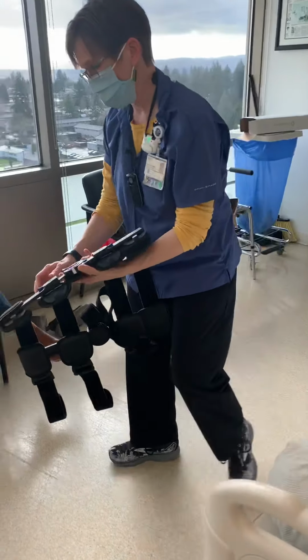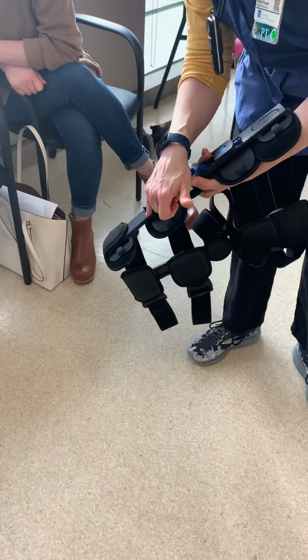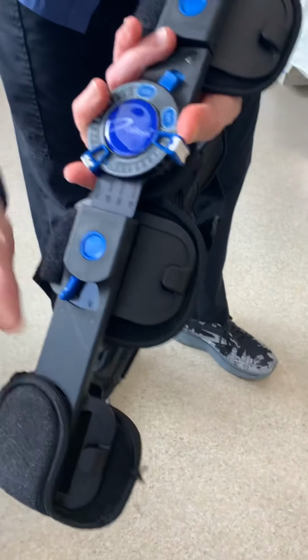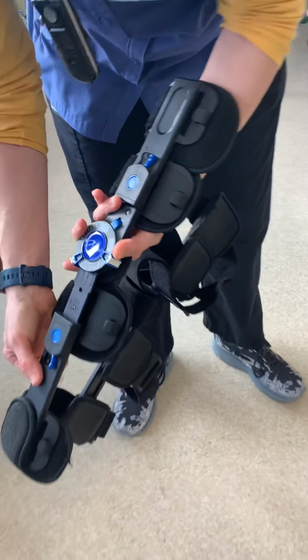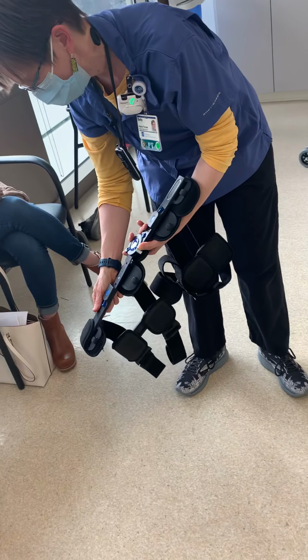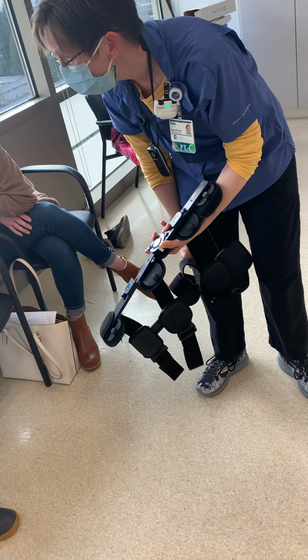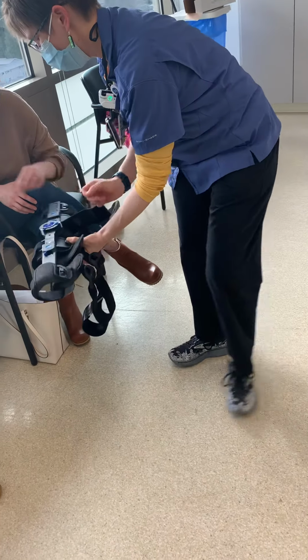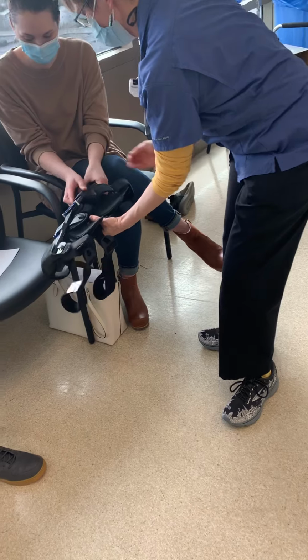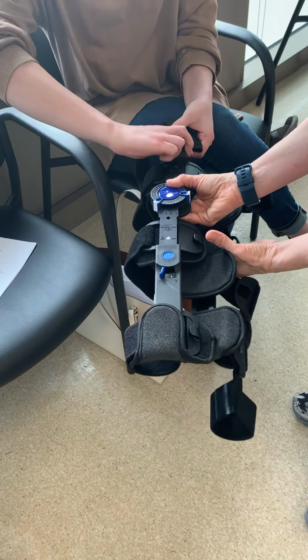I want you guys to take a look here. There's a little padlock and an unlock. If you try to mess with it when it's on the lock, it doesn't do anything. If you hit that so it's unlocked, you can make it longer. Once you get the length you want, you click it back and it stays. Same at the top? Yep, same at the top. Go ahead and play with it there. The idea of locking that is to provide more stability.